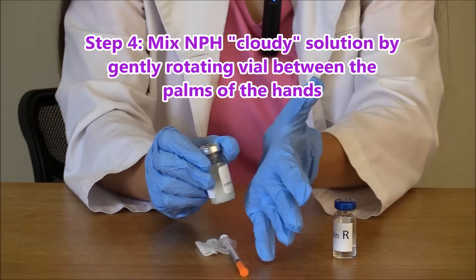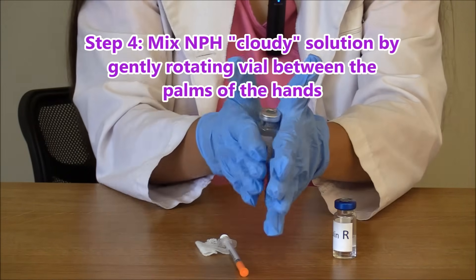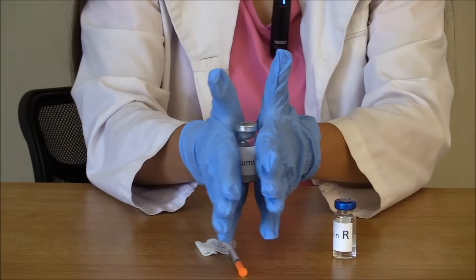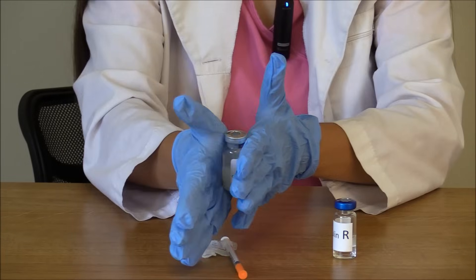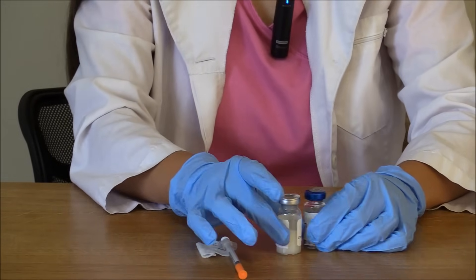To do that, you're just going to roll the insulin gently in between the palms of your hands to get it mixed up, because if you don't do this, it'll alter how much NPH you're actually drawing up. Make sure the solution is well mixed, and never shake it because that causes air bubbles and can throw off how much NPH you will actually draw up.